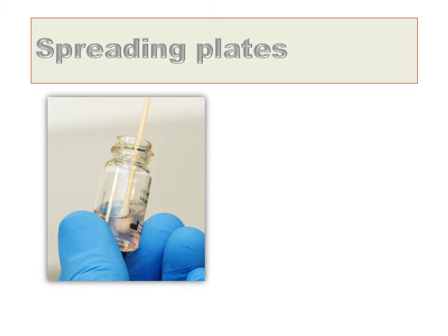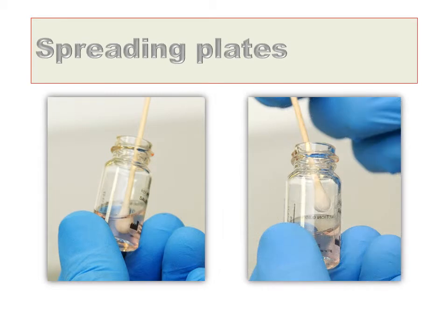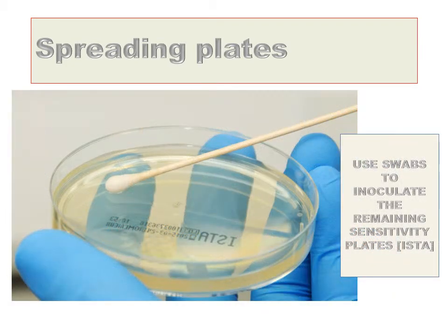Use the sterile saline previously inoculated with one drop of blood to inoculate the remaining two sensitivity plates. Place a fresh sterile swab in the saline, then remove it and press against the side of the glass wall to rinse off any excess fluid by rotating the swab. Then use the swab to inoculate the remaining sensitivity plates — again go from side to side and rotate the plate 120 degrees twice to ensure an even inoculum.